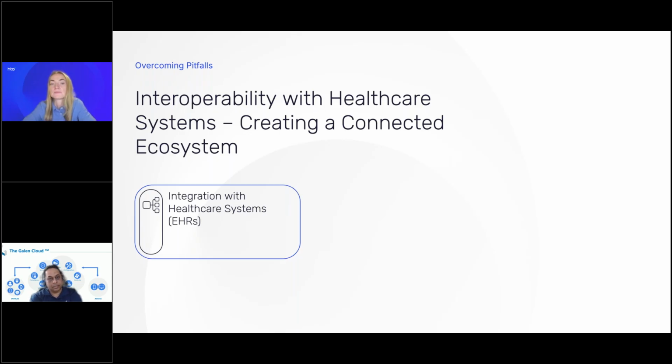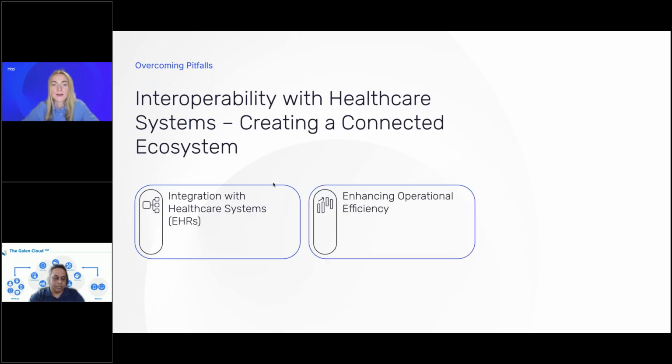Because, for example, coming back to this heart failure monitoring application, if we would be gathering data continuously from the patient, and if you would integrate your application with EHR, you would really make life easier for your patient and provider, because the provider would get data from the patient continuously, right? So they would be able to gather data, get insights, and then make more personalized decisions. So patients would benefit from that. So that is why it's so important to integrate with EHR systems.